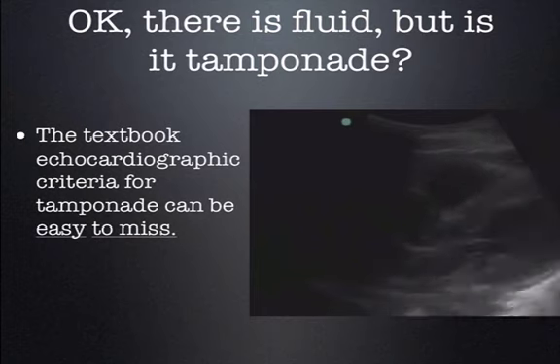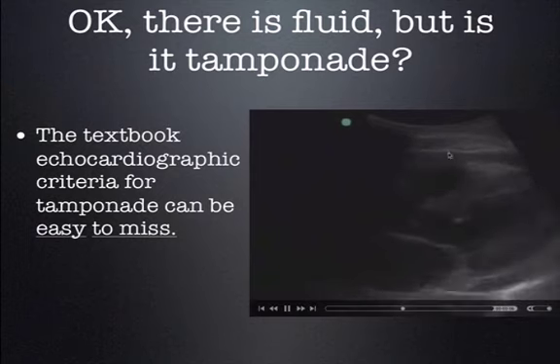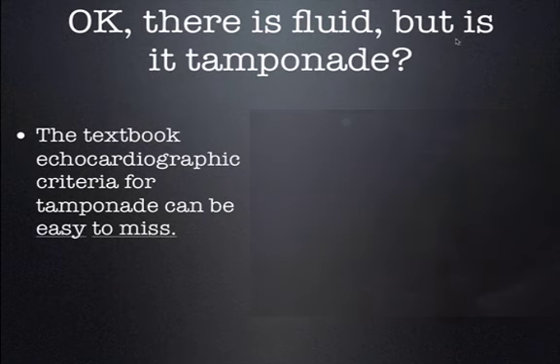Now, this is another parasternal long axis view. In this case, the sonographer is not using standard cardiac orientation and is using a reverse orientation, sometimes considered the emergency orientation. Nonetheless, it's a parasternal long axis view. You can see that bowing of the right ventricular free wall when the patient breathes out. So there's a decrease in right ventricular preload, and that change in pressure allows that right ventricular free wall to bow in. Again, extremely easy to miss.